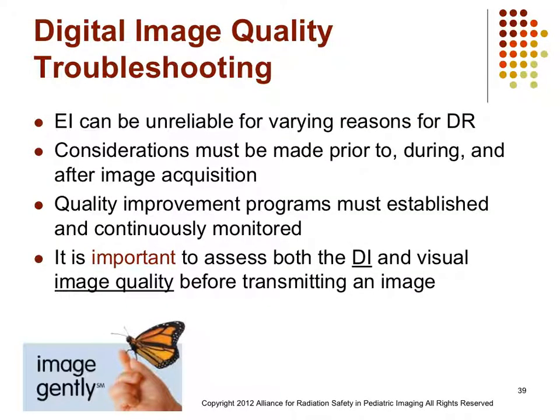So overall, the objective here is really to ensure that we develop a standardized approach to the management of radiation dose specific to the exposure to pediatric patients, to make sure that we produce an image that is of appropriate image quality for the given clinical question. As technologists, we're really just charged with going back to the basics in some regard, making sure that we're looking at manipulating our techniques based on that patient thickness.